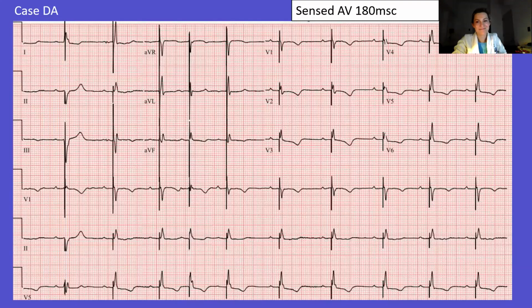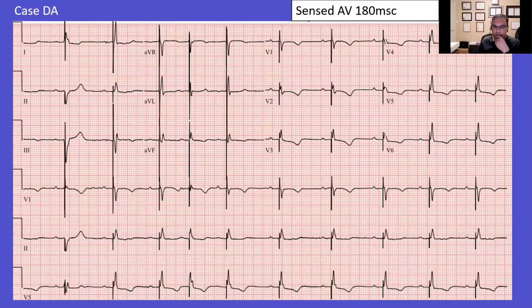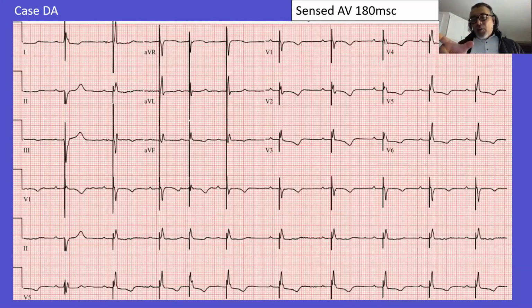Wow. Oh, that's even more interesting. So it was like an unintentional CRT of the right ventricle to correct the right bundle with the RV basolateral position of the lead. Yeah, sometimes you need to give beta blockers just to delay the normal AV conduction, to allow either the right or left-sided branch to recover enough to conduct. Smaller, but nice case.